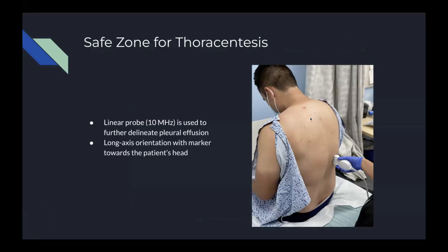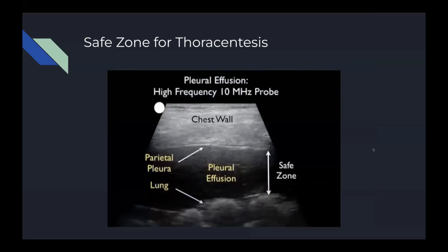As I mentioned before, there is a safe zone that you have to determine for thoracentesis, and this is done using the linear probe. You place the linear probe in a long-axis orientation with the marker pointed towards the patient's head. On this high-frequency probe image, you can see the chest wall, then the parietal pleura, and the pleural effusion between the parietal pleura and the lung. The anechoic pleural effusion is our safe zone — this is where you want the needle tip to stay to avoid puncturing the lung and to effectively extract the liquid.